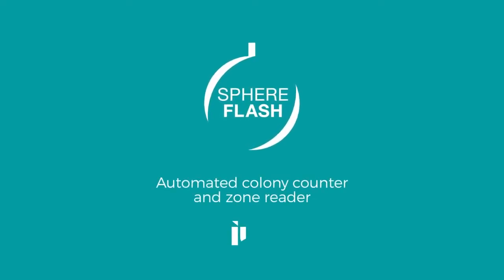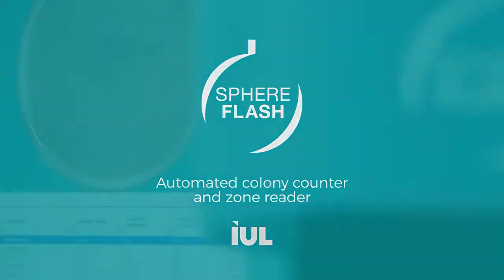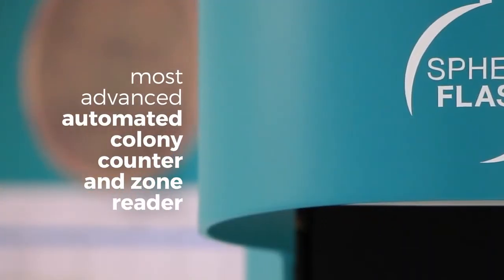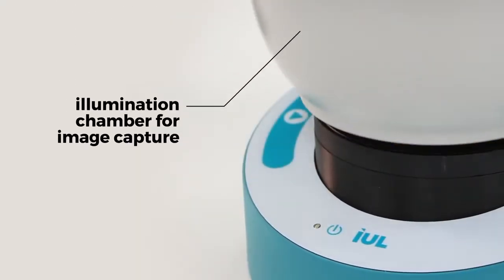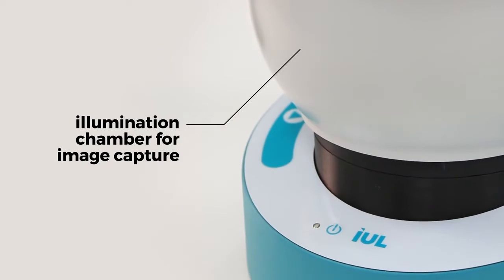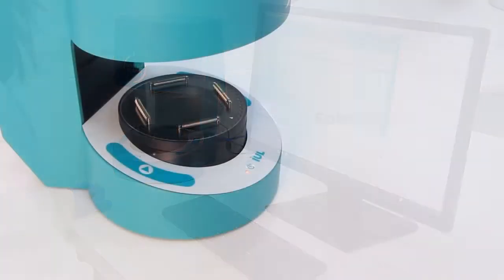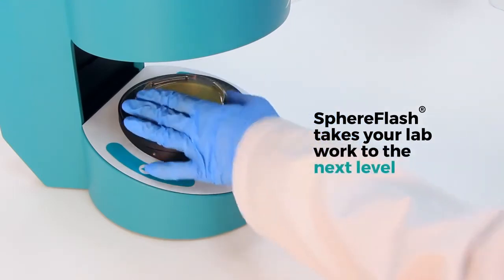SphereFlash Automated Colony Counter and Zone Reader. The SphereFlash is IUL's most advanced automated colony counter and zone reader, featuring the best illumination chamber for image capture available on the market and powerful but intuitive software. SphereFlash takes your lab work to the next level.